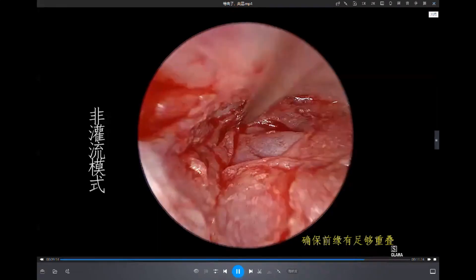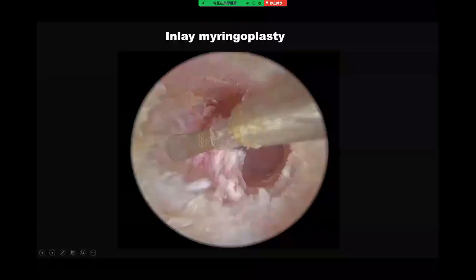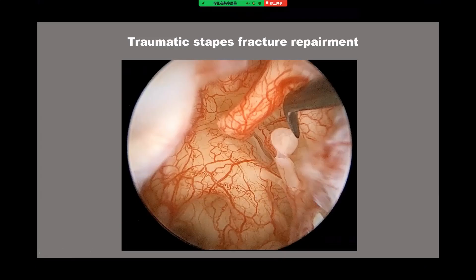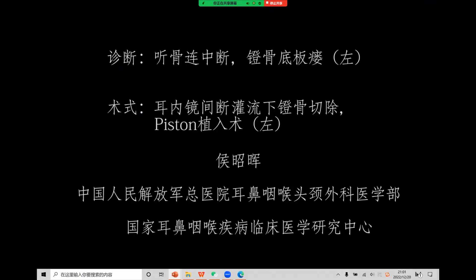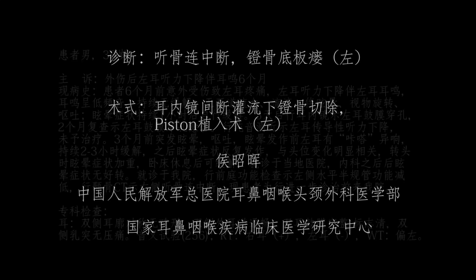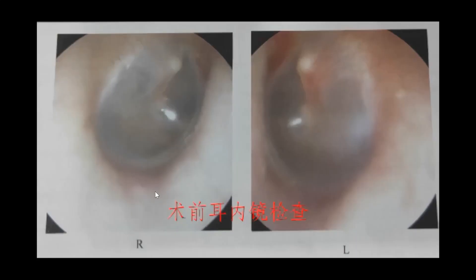The second operation is a traumatic stapes fracture repair. This patient is male and he sustained a traumatic stapes fracture. After that he developed severe conductive hearing loss and severe vertigo.